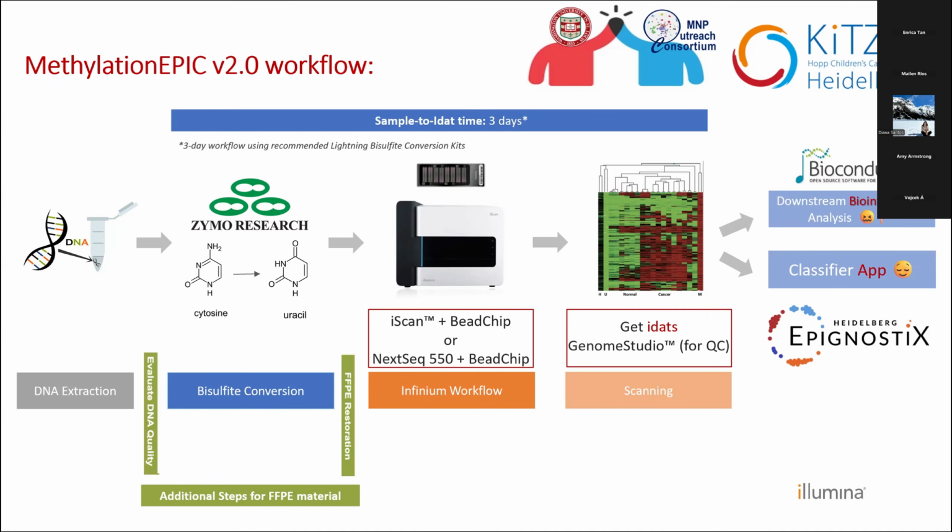And if you bought, for example, the larger 32 sample kit, then again you would need to consume the reagent within 2 weeks, so you would need to run the 32 samples within 2 weeks. So it's just related to batching and which kits you are buying. And of course, when you scale up the kits, the price goes lower. So the 32 sample kit is more cost effective than the 8 sample kit or the 16 sample kit. So this is the reason.